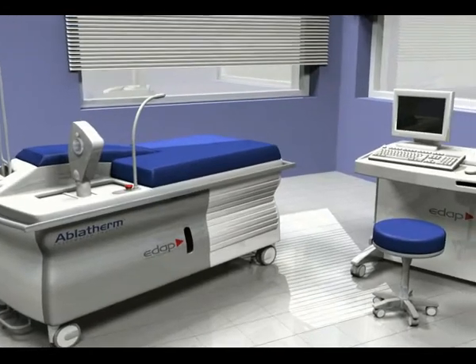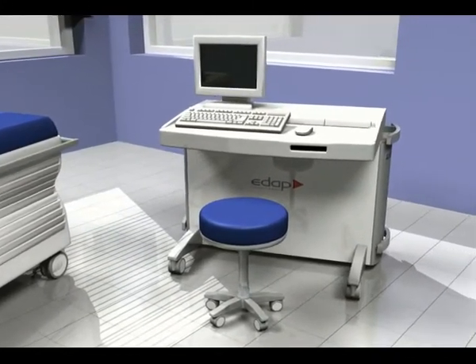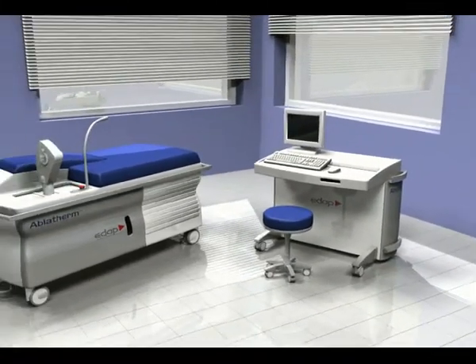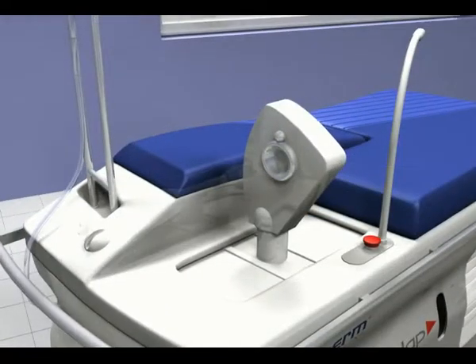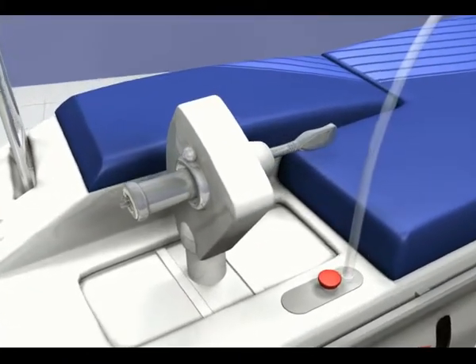The Ablatherm robotic HIFU device is made up of two modules: the treatment module on which the patient is positioned, and the control module which enables the surgeon to plan and check the treatment via a computerized system which guides the robotic and the rectal probe. The probe is installed on a fully motorized support.